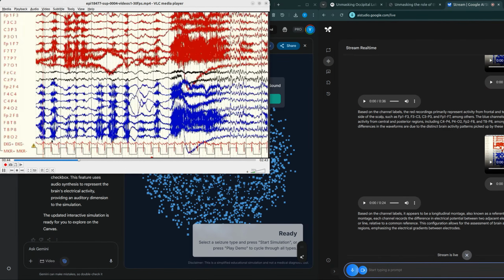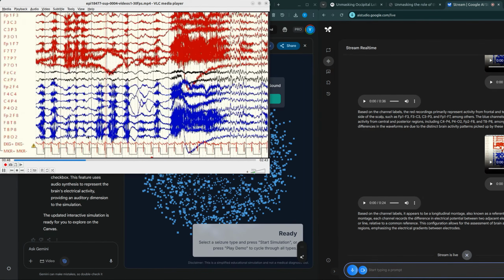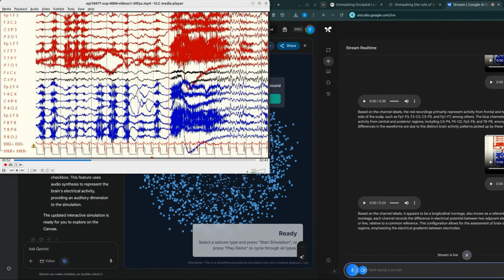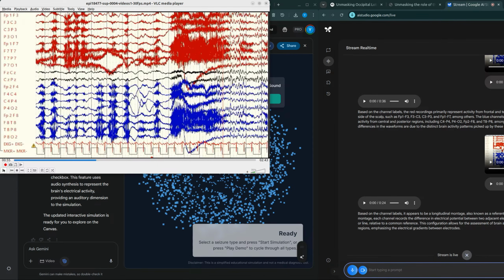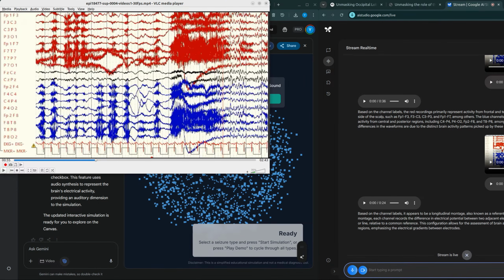Okay, this is really nice. So I'm playing the rest of the video. What's currently happening? What's coming in the signal? Can you again continue pretending to be an EEG expert and tell me what's happening?